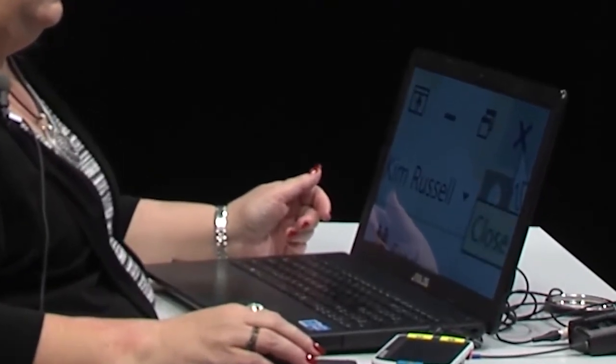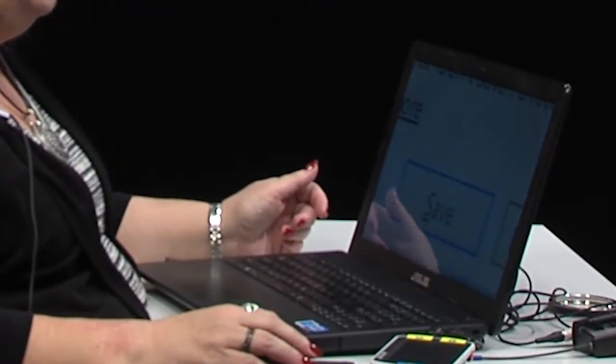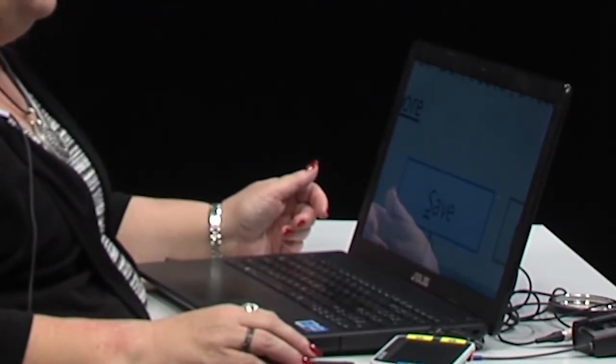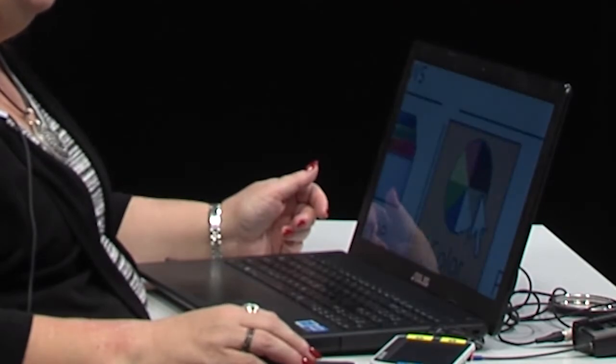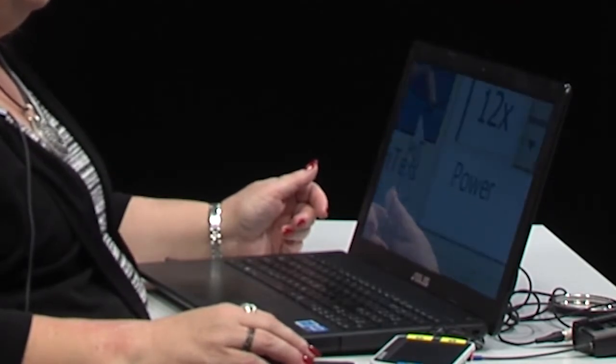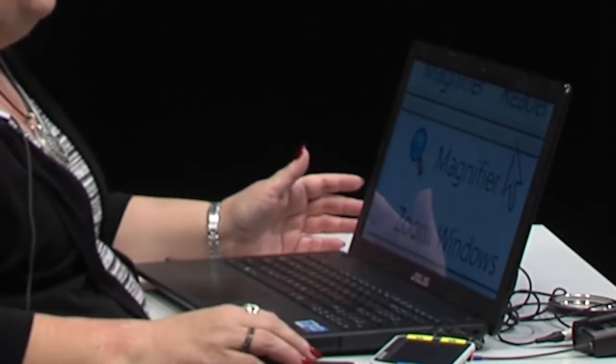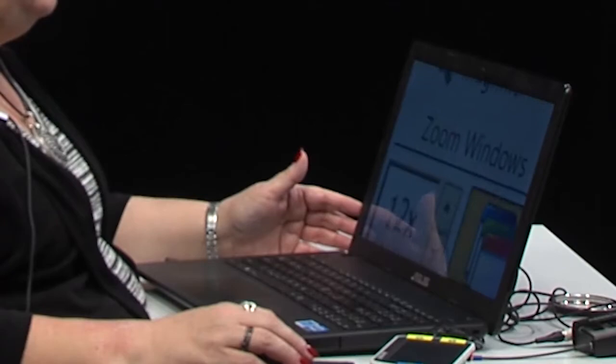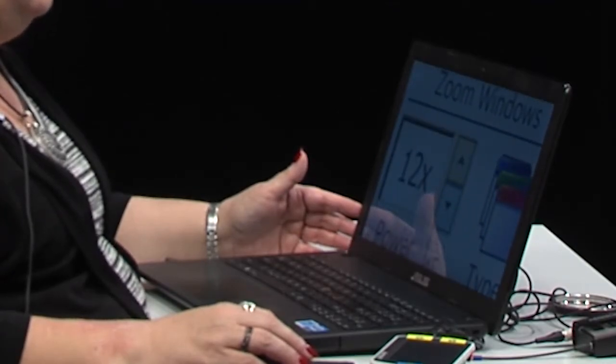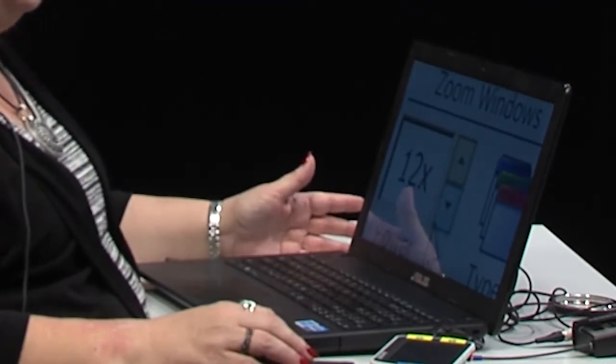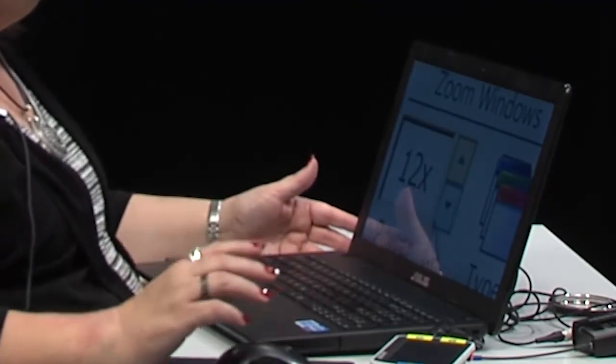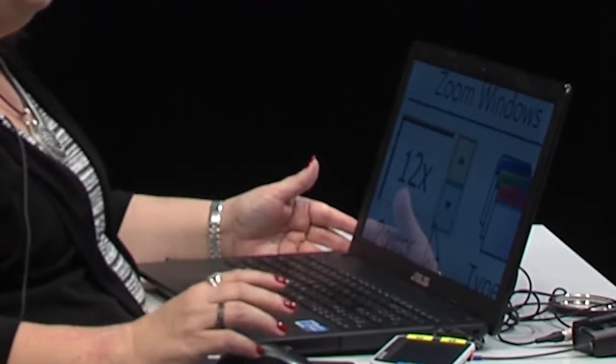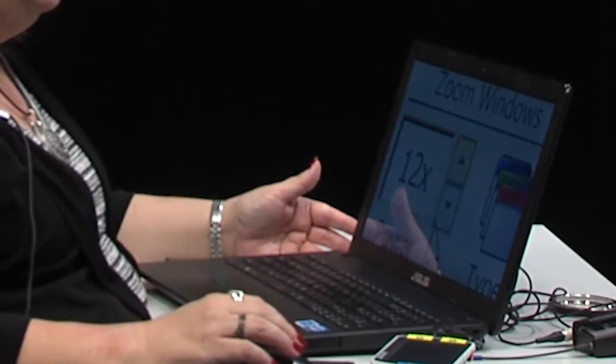Now this is my toolbar for my ZoomText. If I have to read with a 12X magnification, that means I only get to see one 144th of the screen.